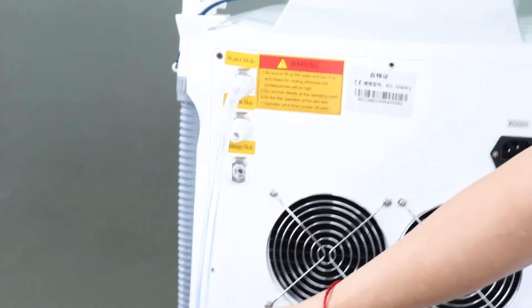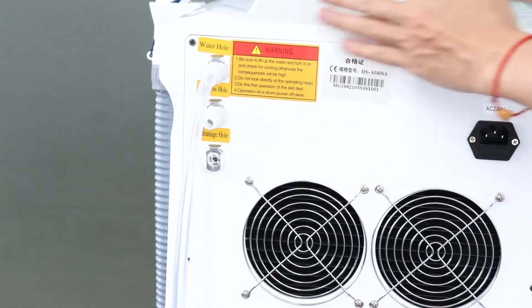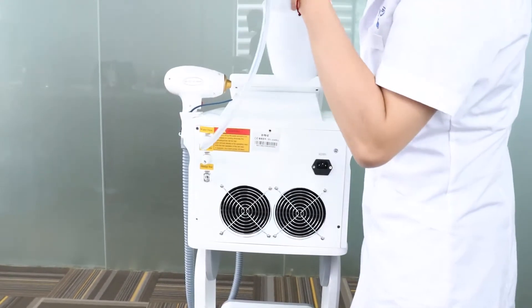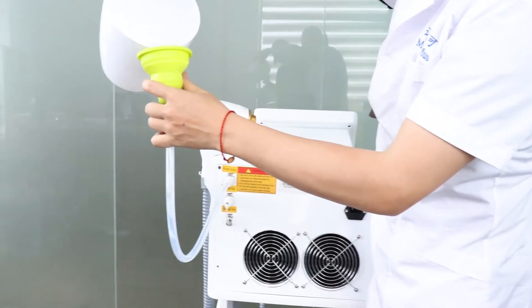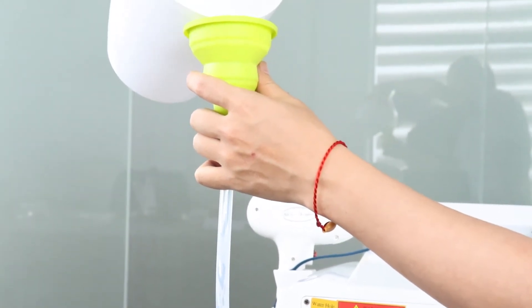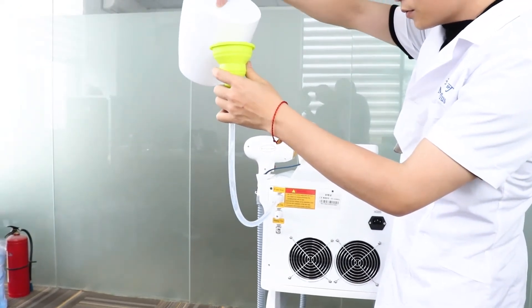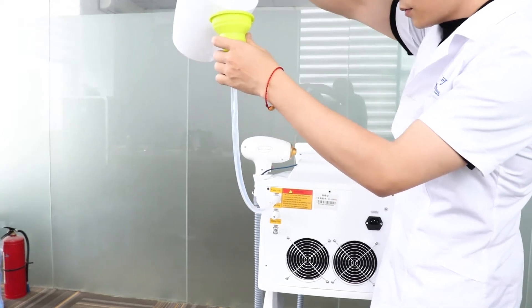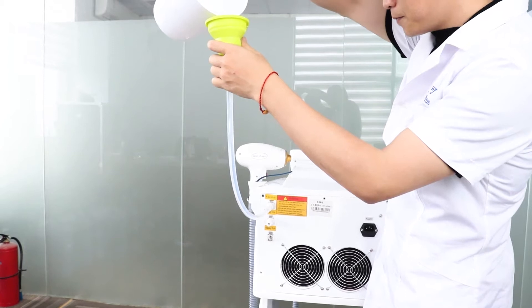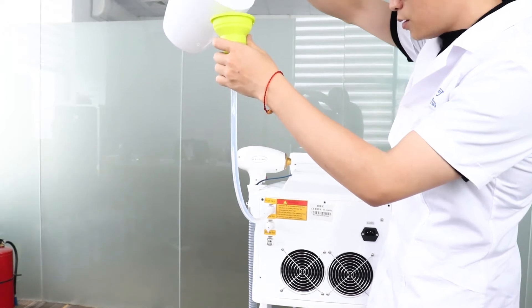Now we add water — just clean water, or distilled water is okay — for the water-cooling section, because inside the water tank... So now we add water. We keep adding water to the machine — just clean water.